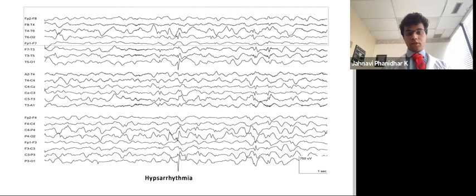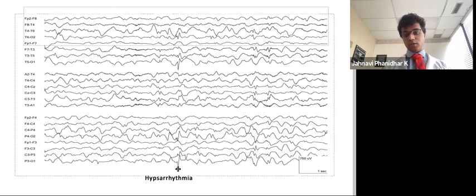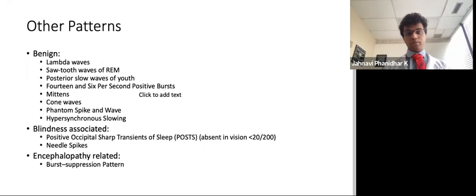It comes from the Greek words hypsos and rhythmos, called hypsarrhythmia, and it has a very high voltage and high amplitude, which we can see here. It's usually between 200 to 400 microvolts, but it can be as high as 1000 microvolts. And as we can see here, the potential is 750 microvolts, which is more than the rest of the EEGs which we compared till now.